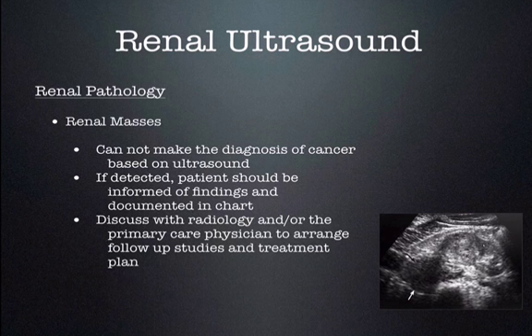After performing multiple renal scans, you will undoubtedly come across a renal mass. The diagnosis of cancer cannot be made based solely on the ultrasound findings. If seen, a patient should be informed of the abnormal findings, and follow-up should be arranged for further testing and evaluation.